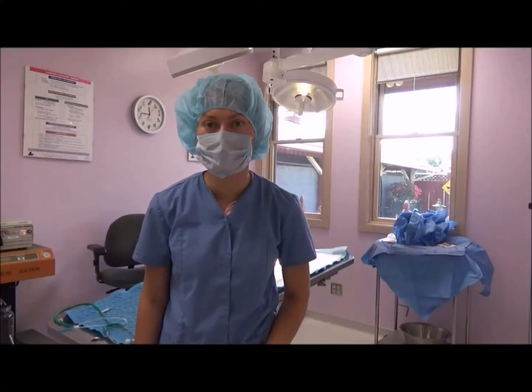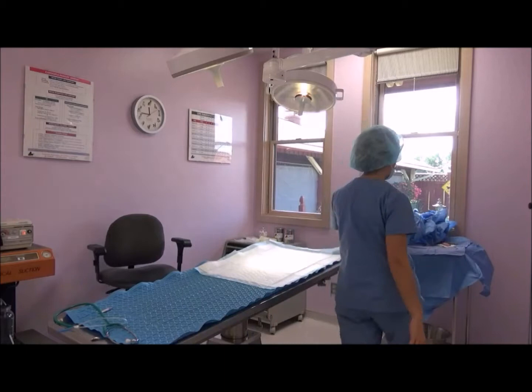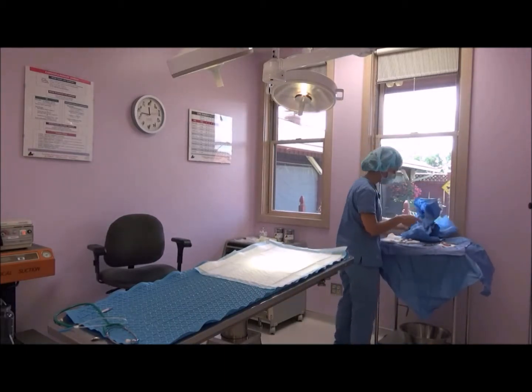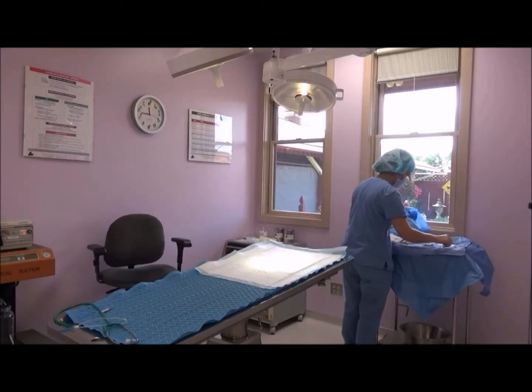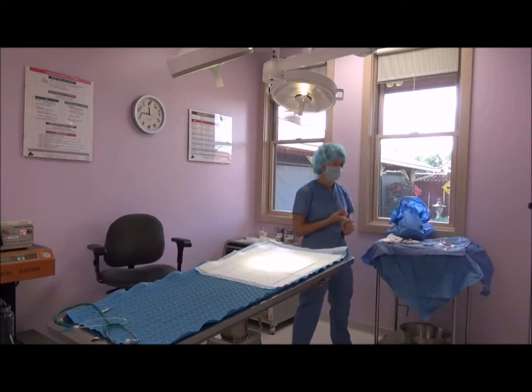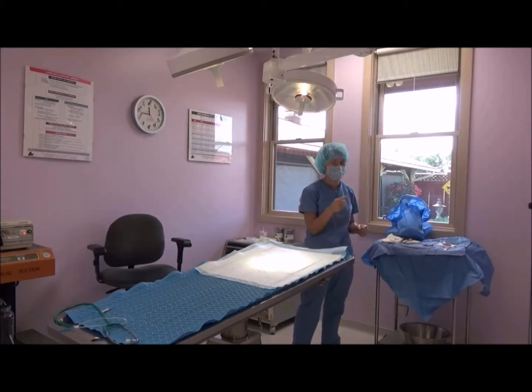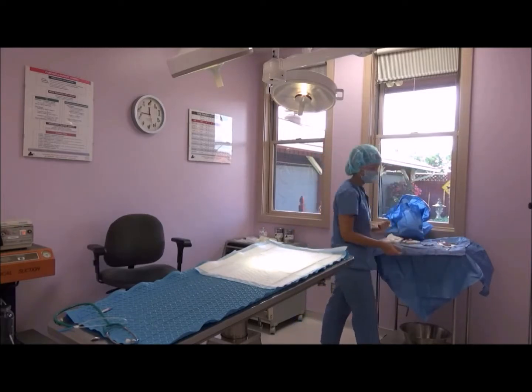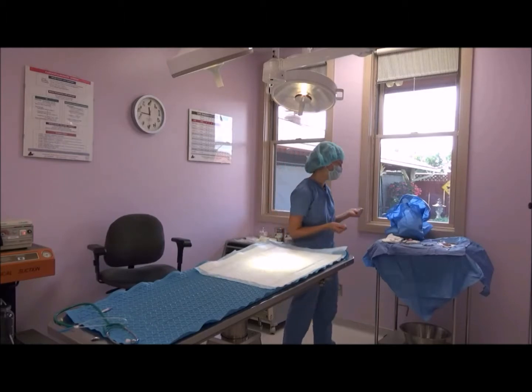Now it's time for the post-surgical cleanup of the surgery suite. So I start with the tools and the sponges, medical waste as well. On here, if there are any blades or suture needles, I would dispose of them into the sharps container. The doctor's actually already taking care of them for me. Normally he's pretty quick about doing that first.